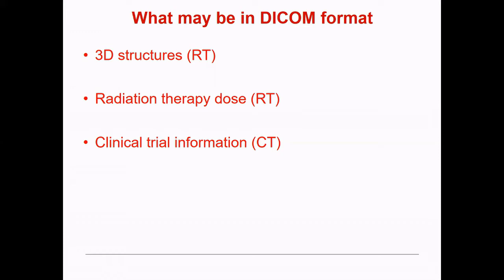And then what I learned, I think 2 years ago, is that there's a DICOM clinical trial field. So if you do imaging in a clinical trial, you could also register patients in that field, writing in the identification number instead of giving the patient a name. So it is actually also prepared for that. But I've checked, and we do clinical trials that involve imaging, but that field is not being used. So usually we have a paper trial registration form where all this information is in, and an empty DICOM CT field.